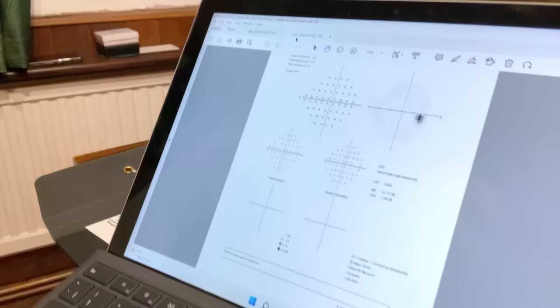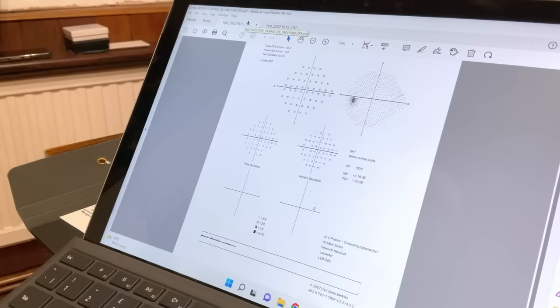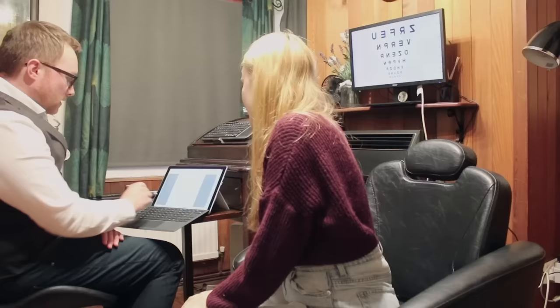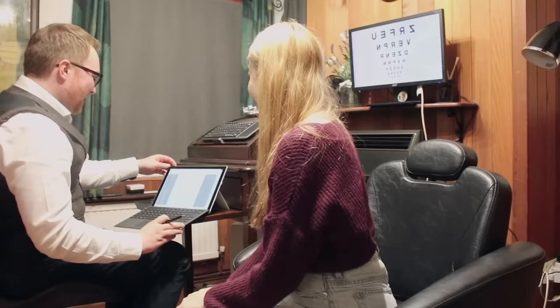And your left eye, just like the photograph, the blind spot is on the other side. It's just where the optic nerve is, as we saw in the photographs. So that's our natural blind spot, but everything else is looking absolutely fine. And the little graph at the bottom shows you were very good at keeping your eye nice and still looking at that orange light. So top marks for you there. Brilliant. Right, okay, so we've finished your eye exam.